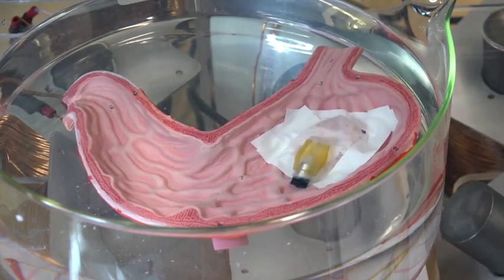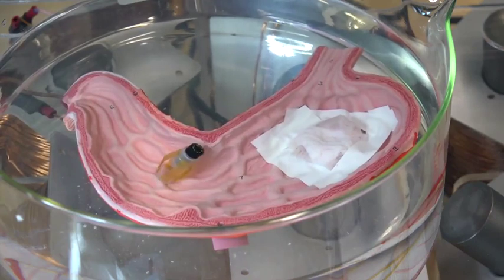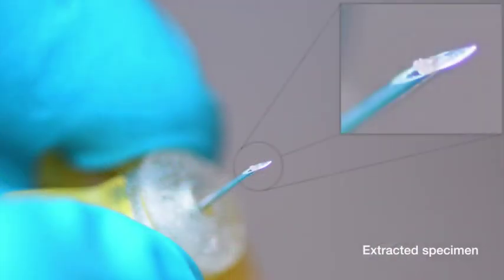After the biopsy, the robot is free to continue further operations. After the demonstration, it was confirmed that a biopsy sample was successfully captured.